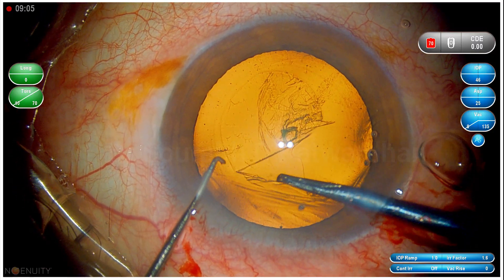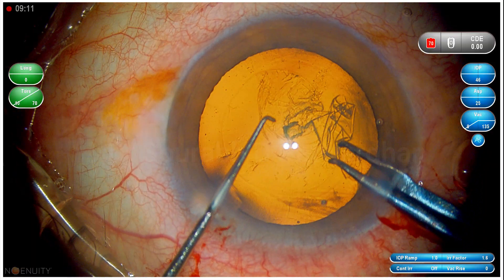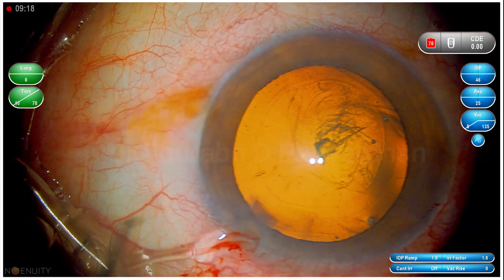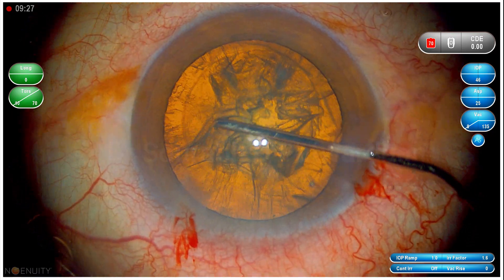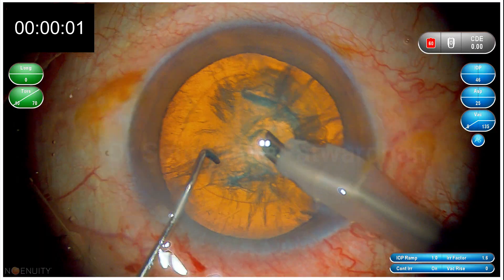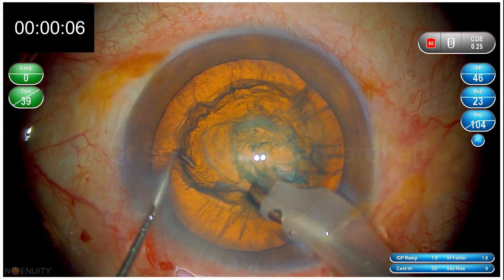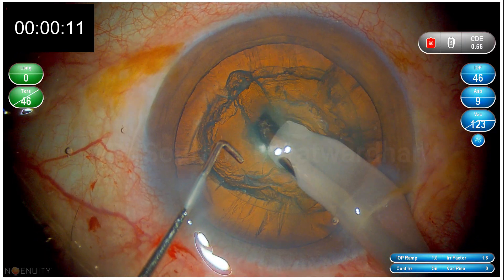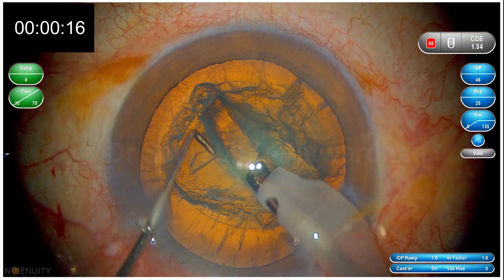Remember, in trench and divide technique you must achieve certain targets. During trenching, you must make a deep groove — almost to 80% depth — and it should be hemicircular. The initial trenches are longer; the deeper trenches are shorter but deep. With each pass of your phaco tip you must cut the nucleus. Many surgeons pass the phaco tip without cutting the nucleus — always it should be in physical touch with the nucleus, so it goes deeper and deeper as it cuts.